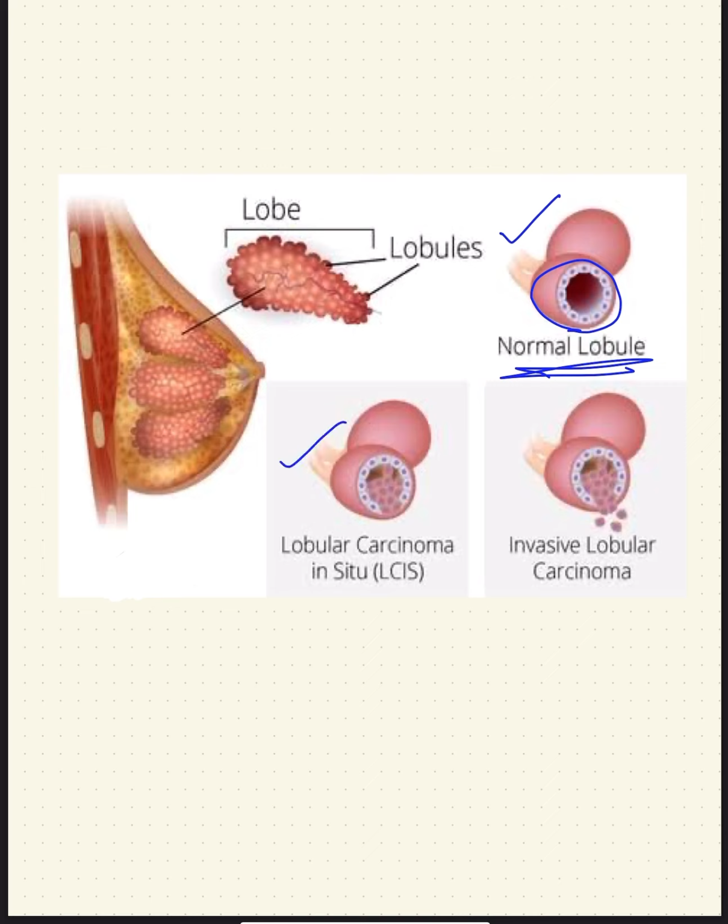In this image, these are the tumor cells, the lumen filled up with tumor cells, and these tumor cells are confined within the lumen. They do not invade into the adjacent tissues. It is said to be in situ. It is present inside the lumen. It is said to be in situ carcinoma, lobular in situ carcinoma.